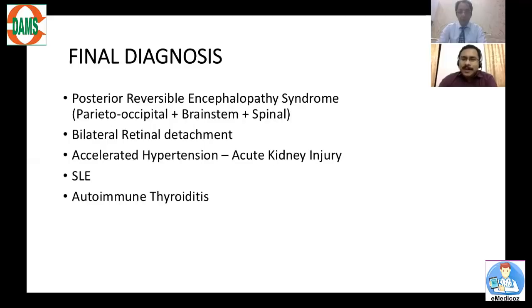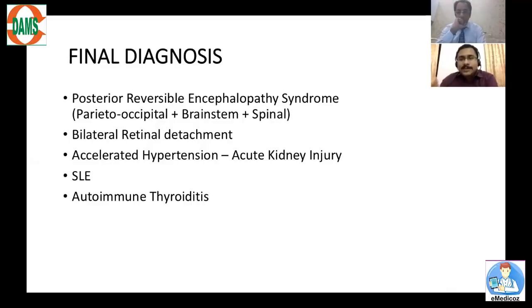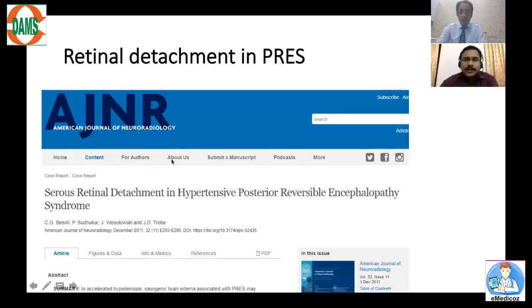The final diagnosis is posterior reversible encephalopathy syndrome — PRES — with parieto-occipital, brainstem, and spinal involvement, with bilateral retinal detachment, in the setting of accelerated hypertension, acute kidney injury, SLE, and autoimmune thyroiditis. The two main atypicalities of this case are: first, retinal detachment occurring in PRES; and second, brainstem and spinal involvement in PRES. Literature was searched to confirm this association.